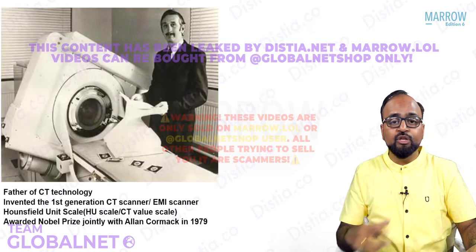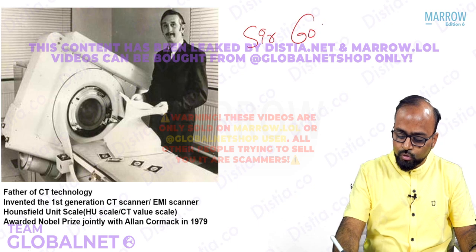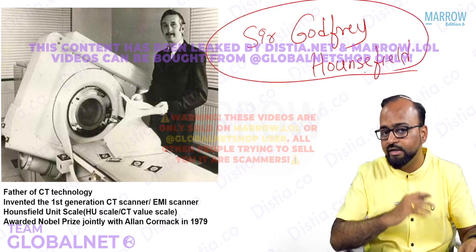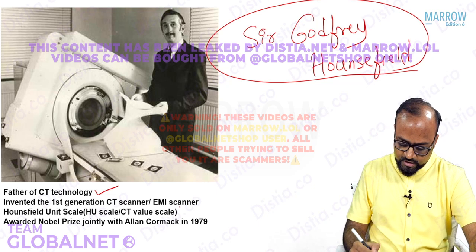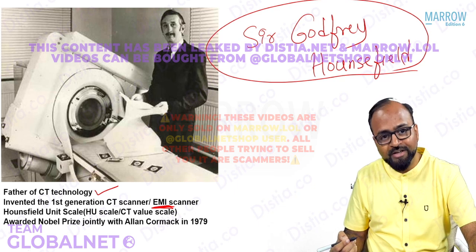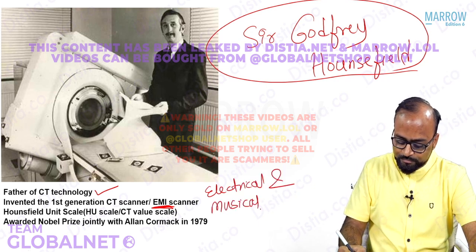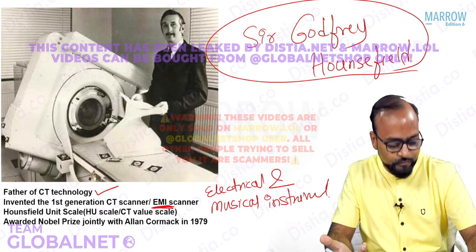Let us jump to the invention of CT scan. Remember, who invented CT? It was Sir Godfrey Hounsfield. Sir Godfrey Hounsfield invented the CT scan. He is called the founding father of CT technology. He invented the first generation CT scanner, which was called an EMI scanner. Not because he took a loan and built it on an EMI, but because he was working for a company called the Electrical and Musical Instruments Company. He was working for this company and therefore the company's name was given to his first machine.